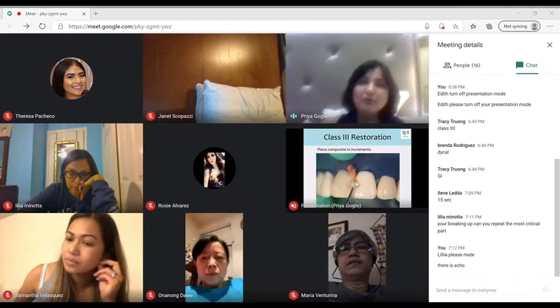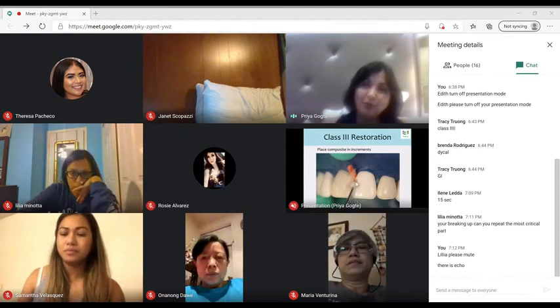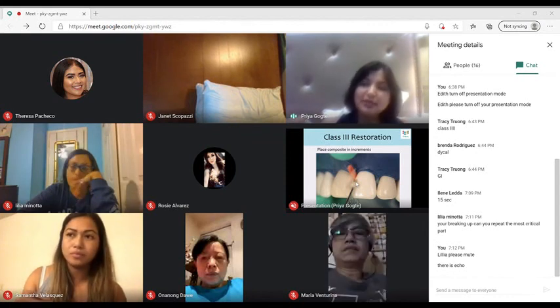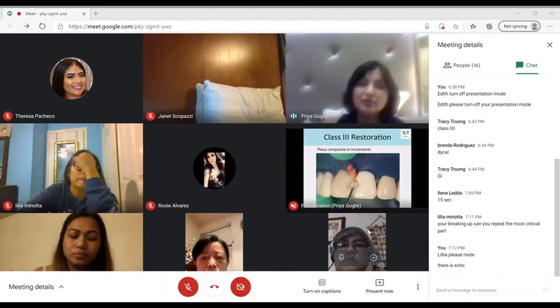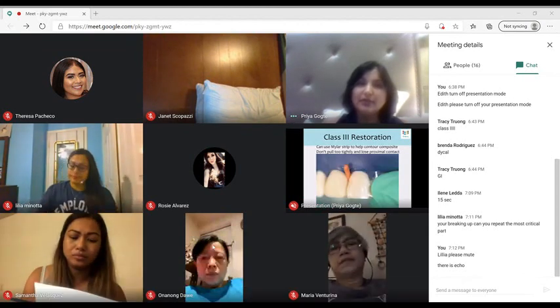Now, when I'm using Voco, which is prime and bond mixed, my assistant has bond bottles separate, and she will pour the bond a little bit on a separate area, and then I will dip my micro brush into that, and I will use it. And it is very, very helpful. And it doesn't change the composition of composite.